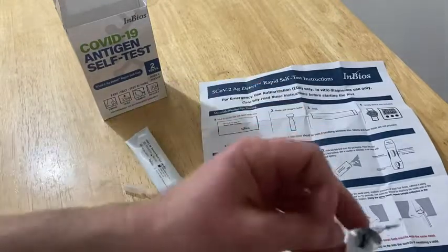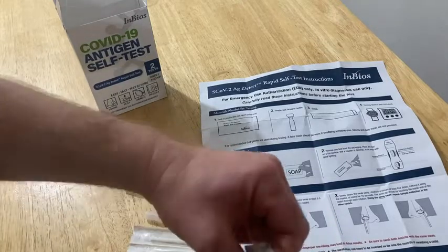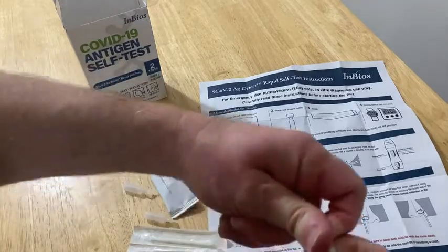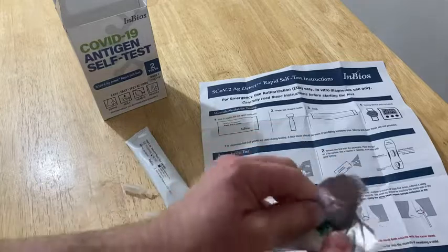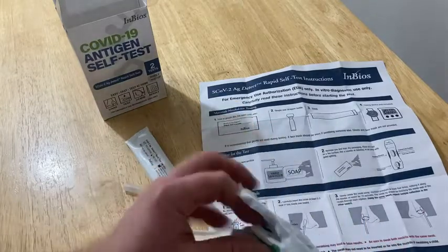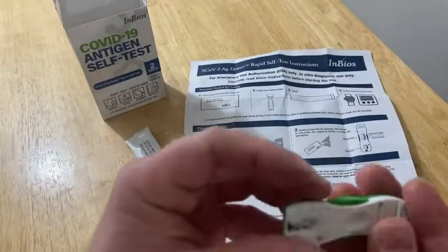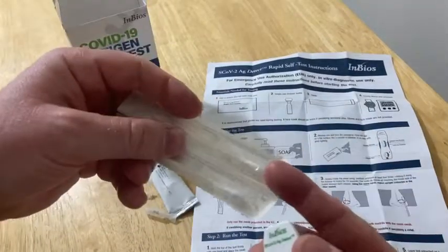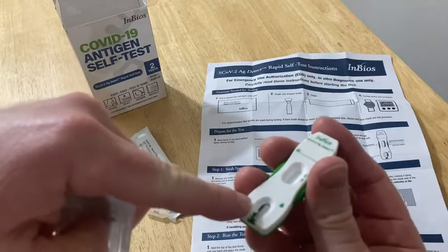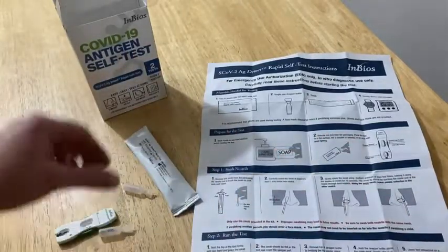Now it's been opened, so we might as well continue. These things are super sealed, very hard to open — maybe I was opening it wrong. There we go — scissors would do it though. So this is what it looks like, what's in this mysterious package. You get this little device here, and you insert the swab — it goes in there. Then you put the drops in. The directions are very precise and very clear, so definitely read the directions.